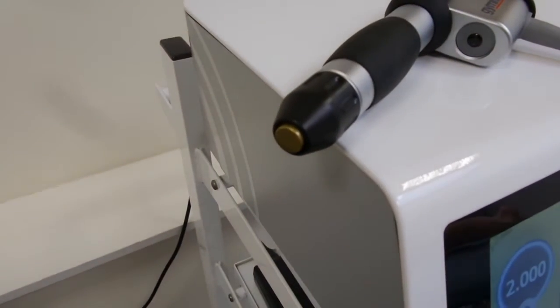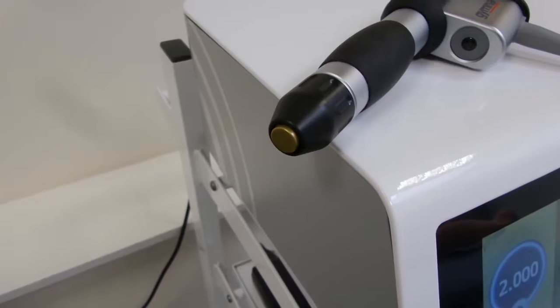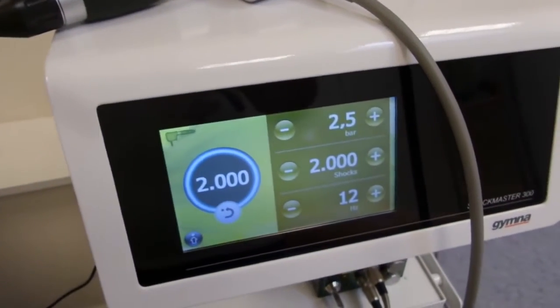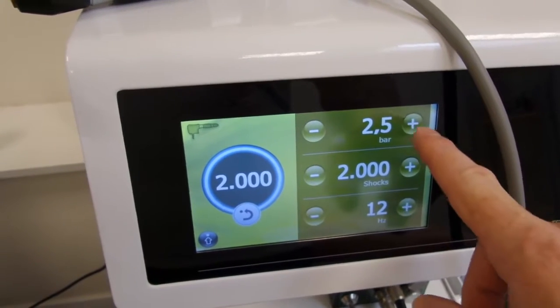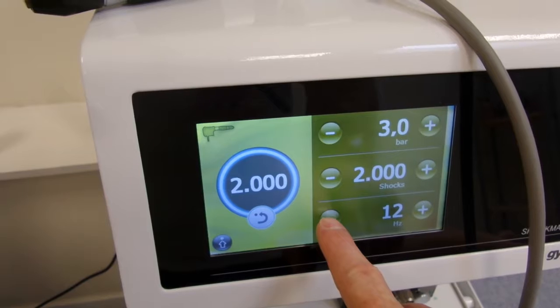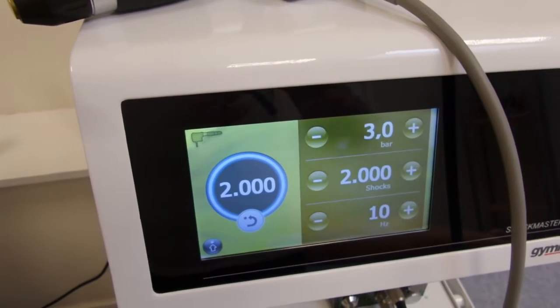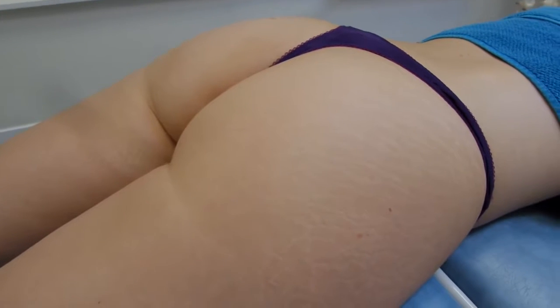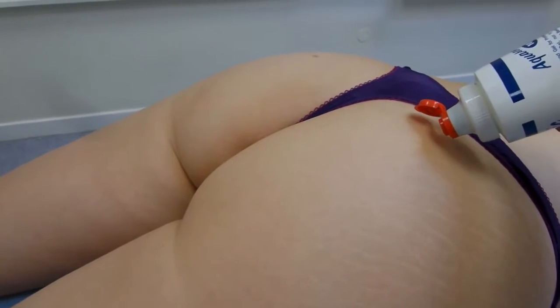We're going to do treatment to the piriformis using the concave deep impact 15mm copper coloured head on the Gymna Shockmaster 300. We're going to take the power up to 3 bar and bring the hertz down to 10 hertz. The machine's set to deliver 2000 shocks, but we're not actually going to do 2000 shocks.